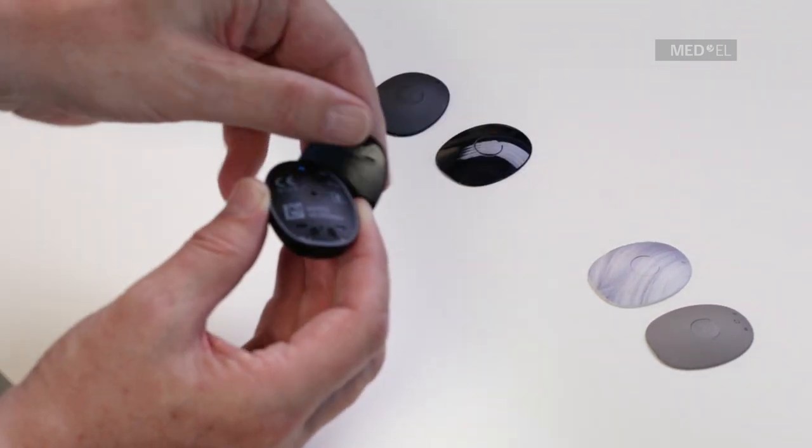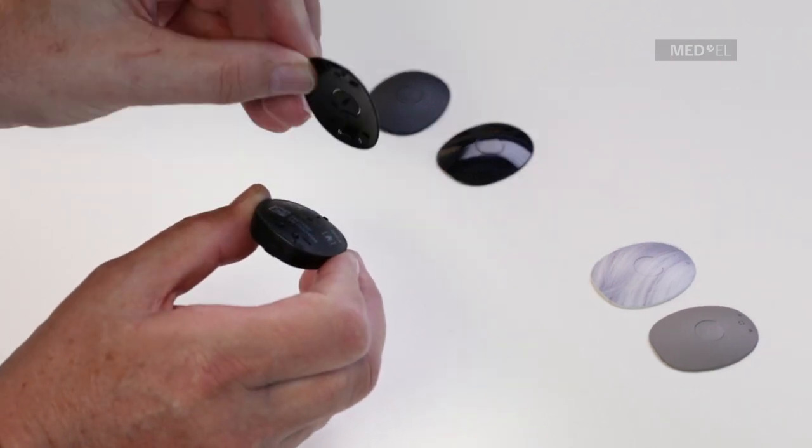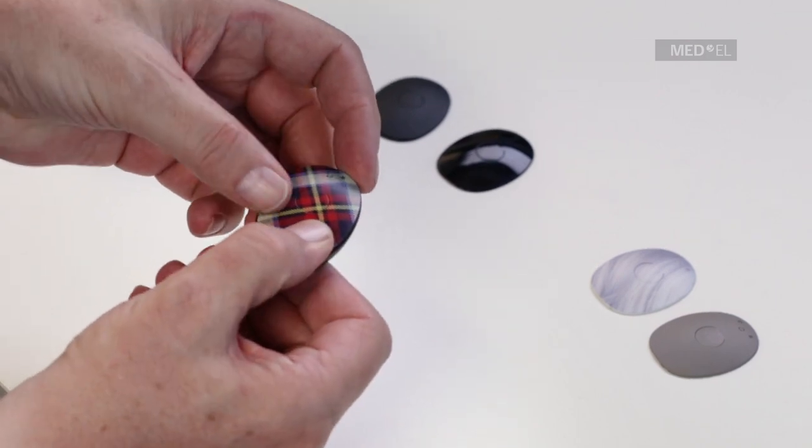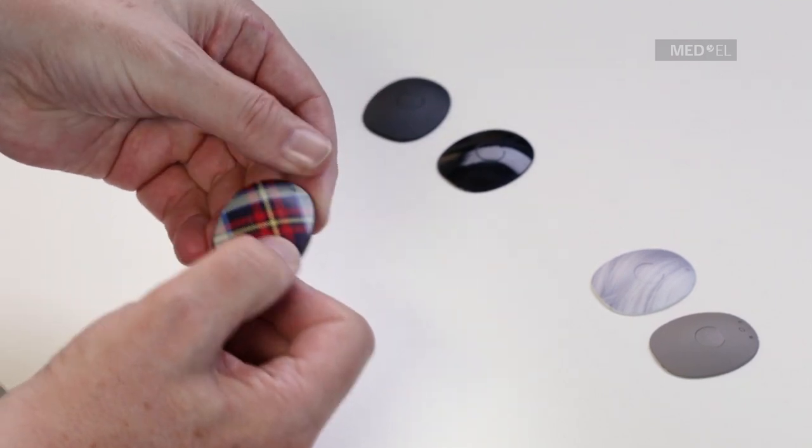Position the new cover over the processor and push it down until it snaps into place. The cover should be changed every three months to keep RONDO2 in good working order.